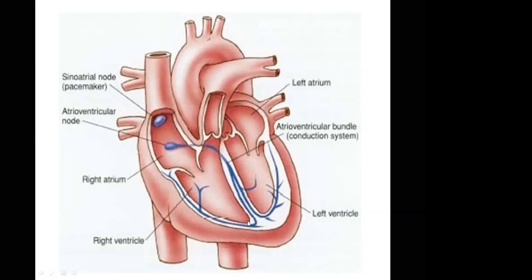Another catheter can be passed through the apex, which, depending on the number of segments of that catheter, as I said, we will see in the EP lectures. The number of segments will determine proximal RV, distal RV, or proximal, mid and distal RV. And that catheter can be in the RVOT. Then another catheter can be in the coronary sinus. For the coronary sinus, basically what you want to determine is the wave between the left atrium and the left ventricle.